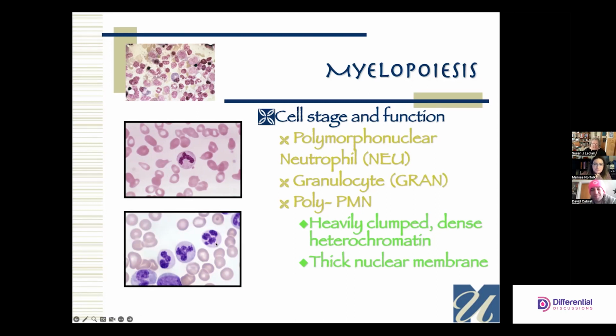These cells, this is definitely a poly. What granules are you seeing? They're small. They're grainy. Well, then I shouldn't be comparing this cytoplasm and saying only cells that look like this are polys. This is definitely a poly. So look at the cell, find yourself a good one, and it will make your life easier.